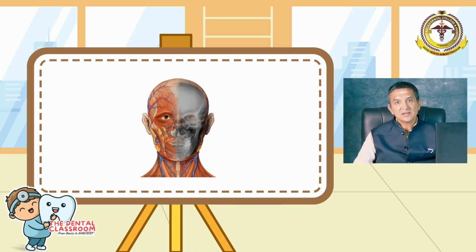So a chairside examination should not be replaced by a cephalometric evaluation, and in case there is a controversy or a mismatch between the clinical view and the cephalometric view, the importance should always be given to the clinical view. A cephalogram is different from a natural head view of the face because it is standardized and taken with a very special equipment called a cephalostat, and is taken as a lateral cephalogram.